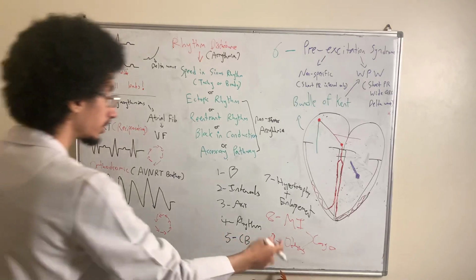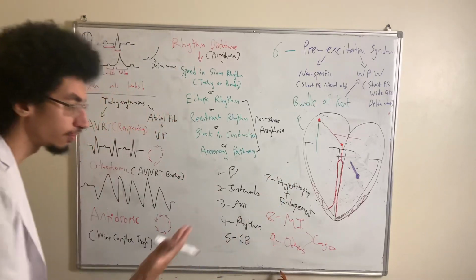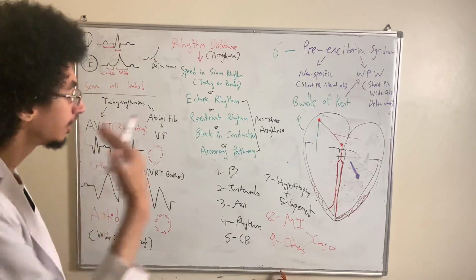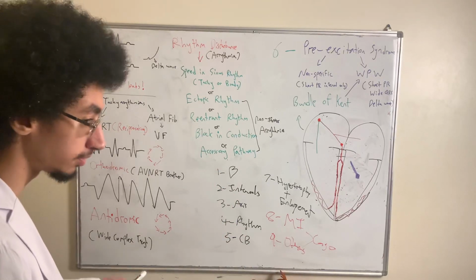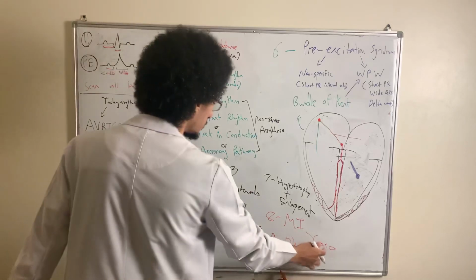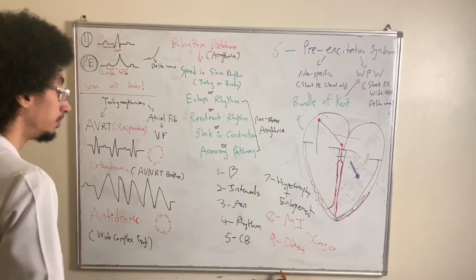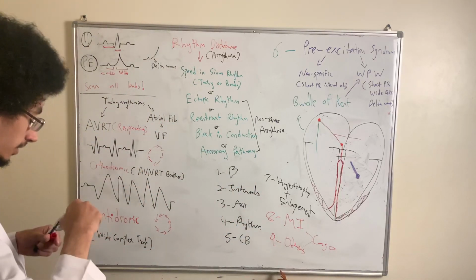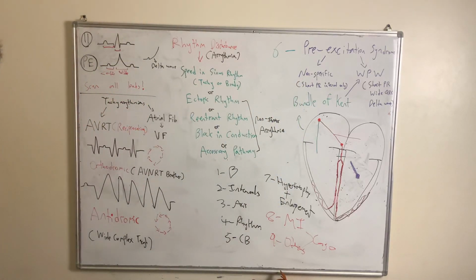So it's according to the case. If you have suspicion of MI, you will order the EKG and you look for it. If you have suspicion of pericarditis, burning chest pain radiating to the back, pericarditis, pulmonary embolism, hyperkalemia, and so forth. So step 8 and 9 is according to the case. But for the sake of our videos, in the next one, we will be in order, number 8 and number 9. So it's a total of 9-step pattern. So now that we've summarized this, let's talk about step number 6, pre-excitation syndrome.